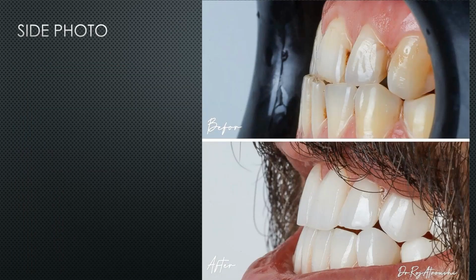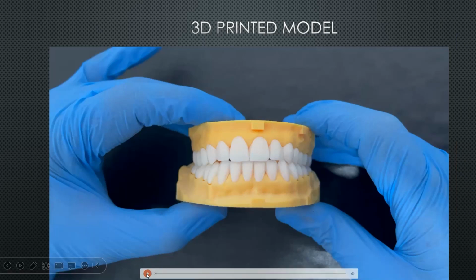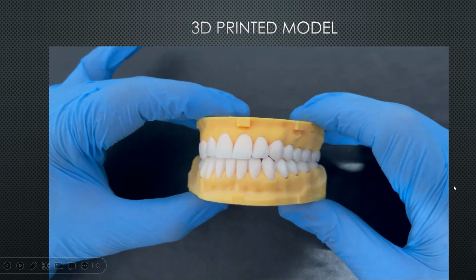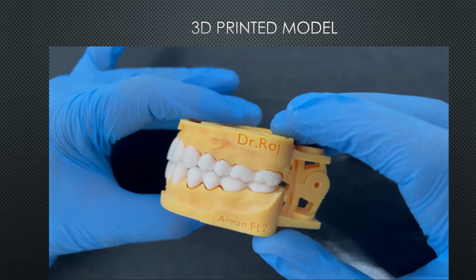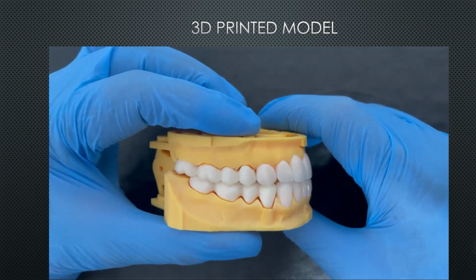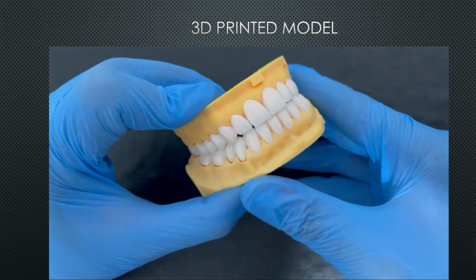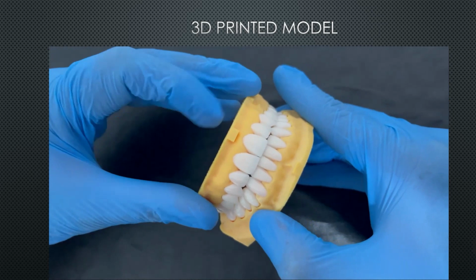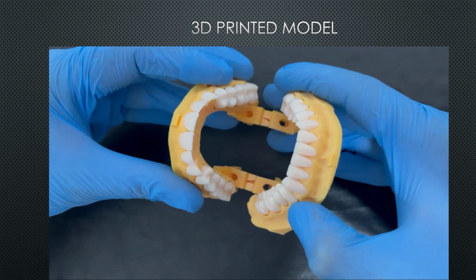take another photo. This is the 3D printed model, and we take a look at the case. We see here these anteriors are veneers, those are bridges. What we did is distribute occlusion on the posterior teeth more and make a slight occlusion on the anterior teeth. We released the pressure on the anterior teeth and distributed it normally to the posterior teeth. And you can do it. You can put glass ceramic on a bruxism patient, as long as you know how to distribute your force on the posterior teeth.